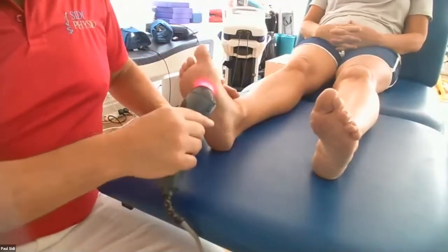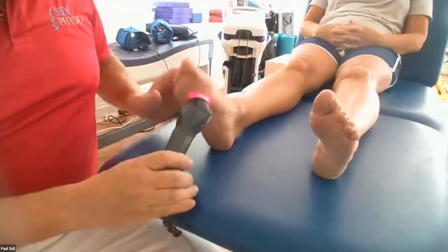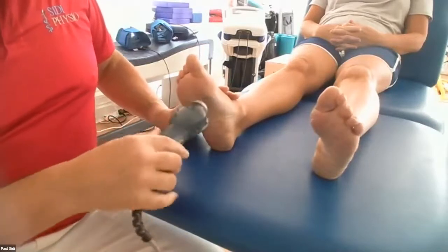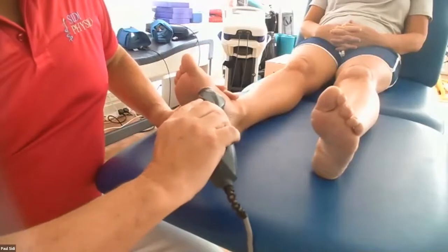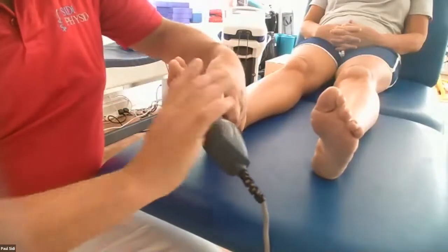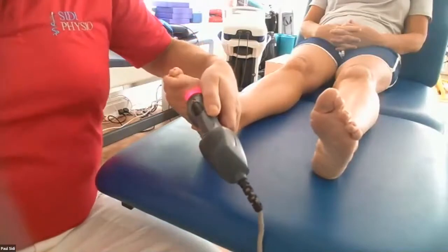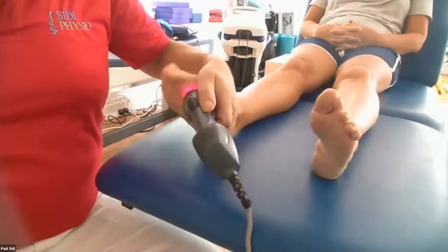And keep on going. I'm just going to wait for it to stop the first time. You'll see how easy it is. It just stops itself. So it stopped itself, and I'm going to move it to the next point. Now I'm going to get on here, move it out of it, get moving that foot, please. And just keep it on there. And so on. It will keep on going until it stops.